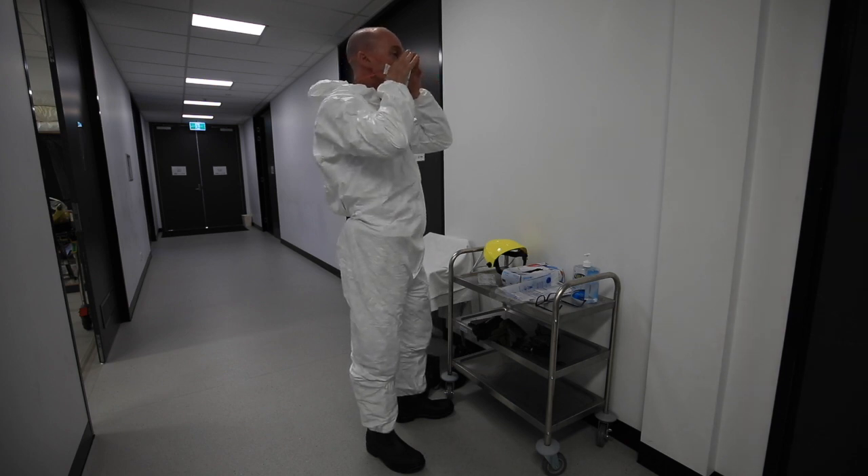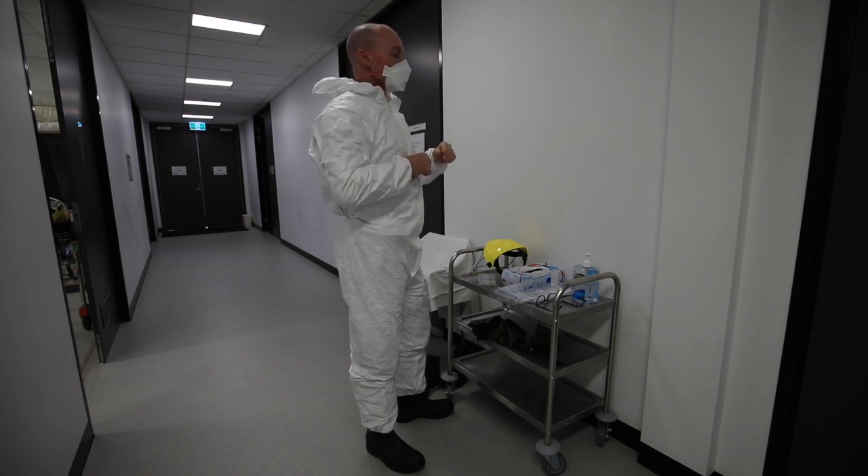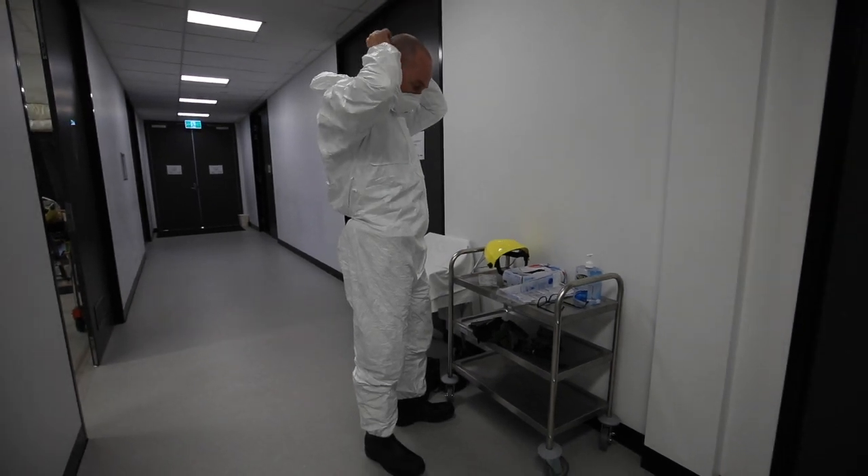Now I've got my fit test. I can feel the mask draw on sharp inhalation there, so I'm happy with the fit test.